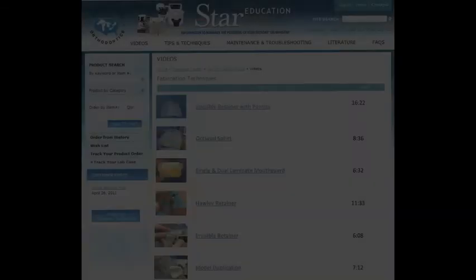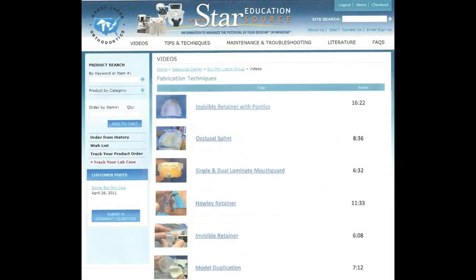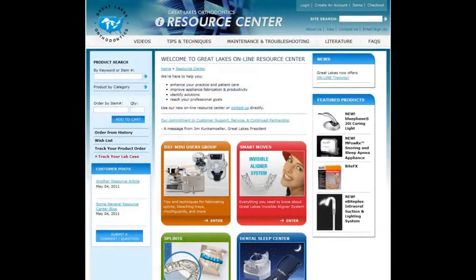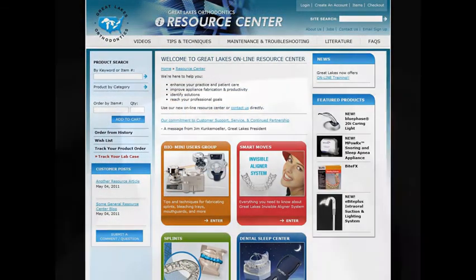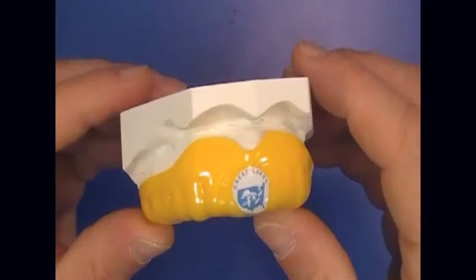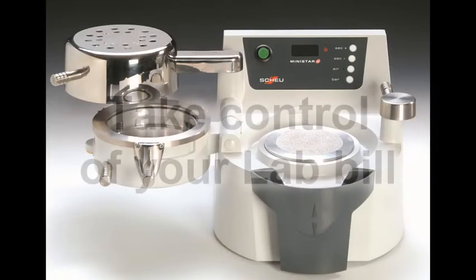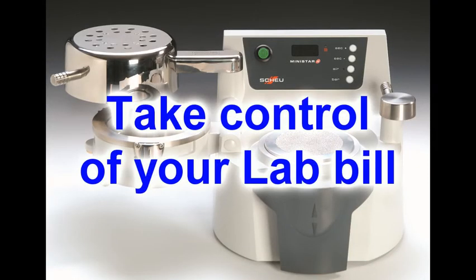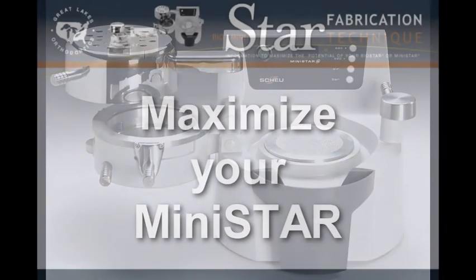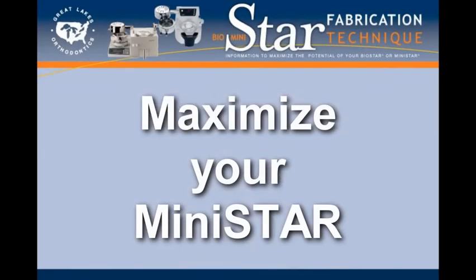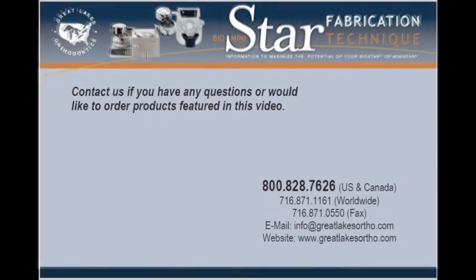These technique videos, along with the other information on the Resource Center, can show you how to get the most from your machine and how to ultimately take control of your lab bill. Maximize the potential of your MiniStar.